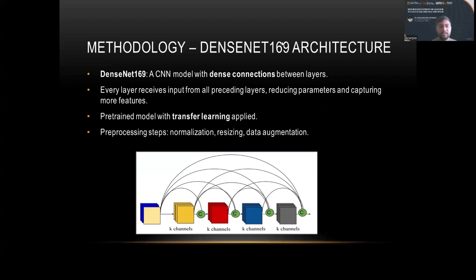To explain this, consider how a traditional system works. Typically, domain experts would define features such as microaneurysms, exudates, or hemorrhages, which are signs of diabetic retinopathy. Based on these features, rules are created, such as detecting pixel intensity changes or shapes that may indicate abnormalities. However, these handcrafted features cannot fully capture the diversity of retinal structures.